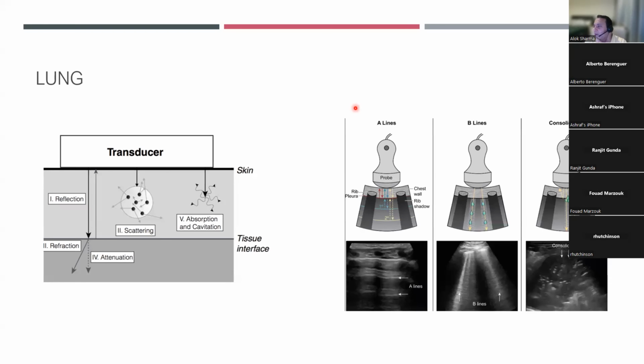So just again, going through that concept. Your probe is generating sound waves. Those sound waves are moving, if the probe is aligned properly, perpendicular to the tissue. Naturally, it aligns best with tissue that has good reflective surfaces and reflects back.